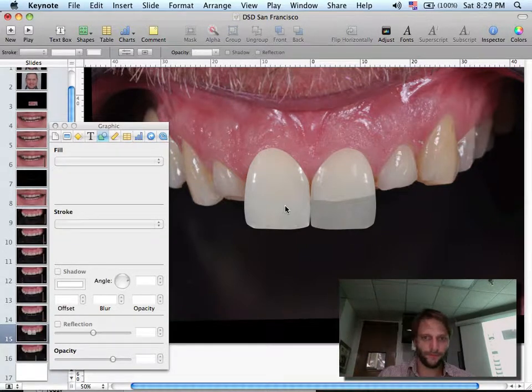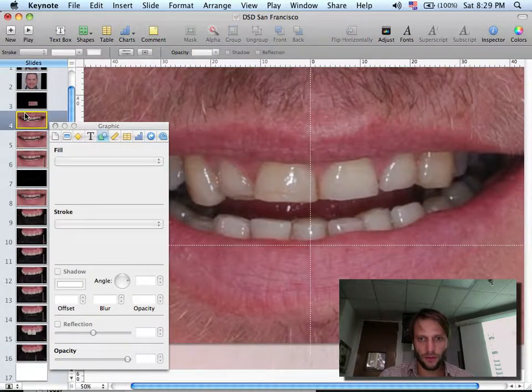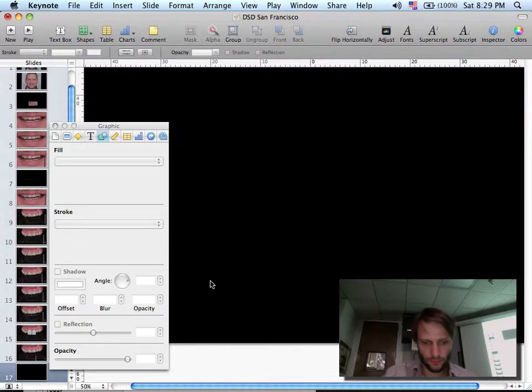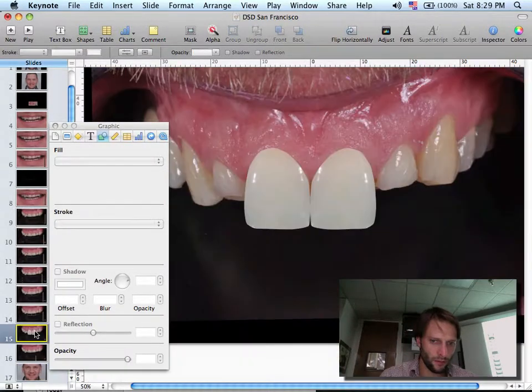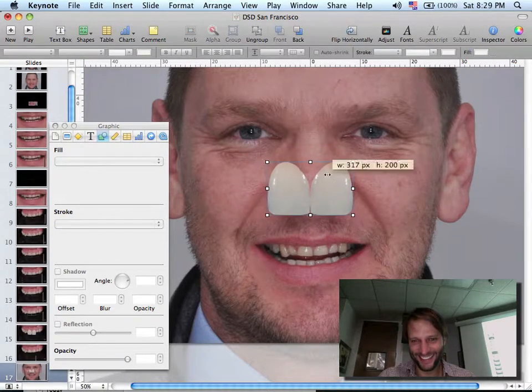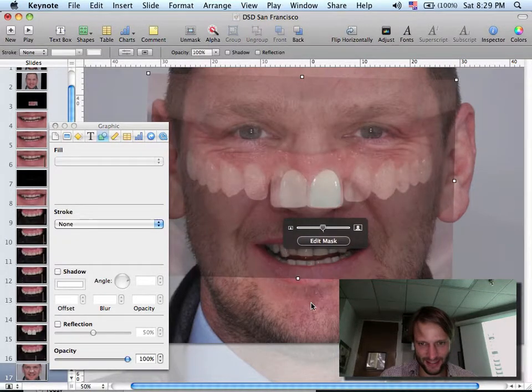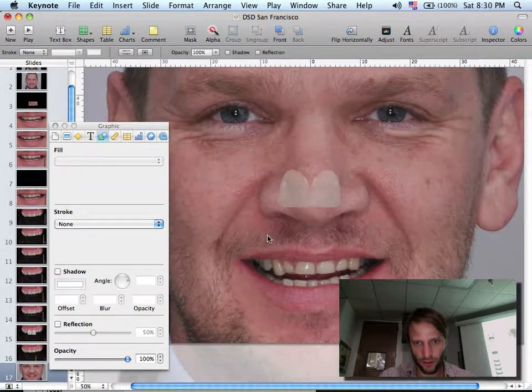The other thing you can do is that you can bring this to this picture or to this picture. So if I bring this over here, for example, and then I bring it over here, that's it, finish. Nice. I can put some translucency here just to see what I'm doing here.